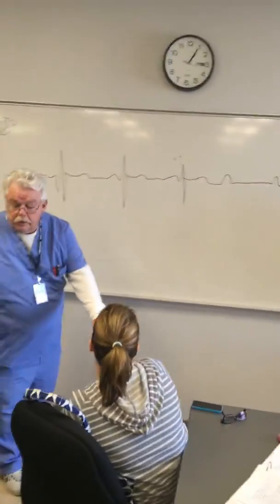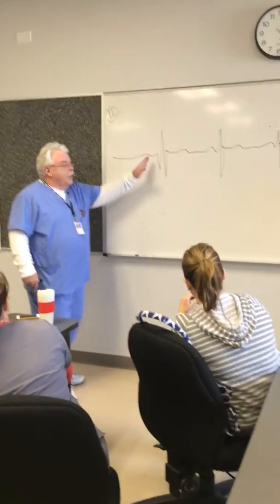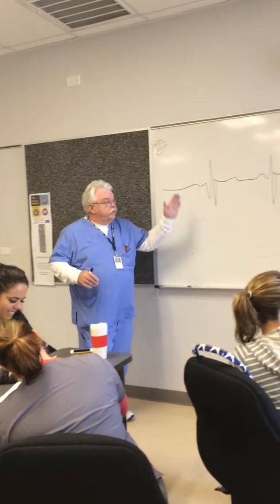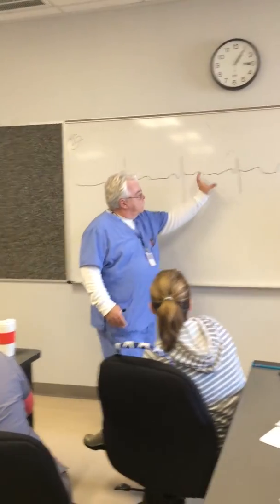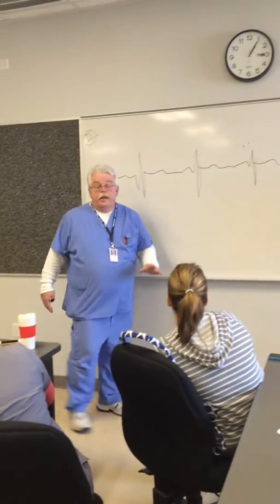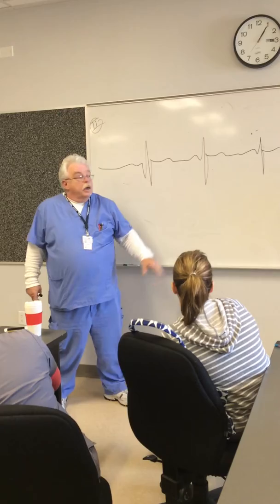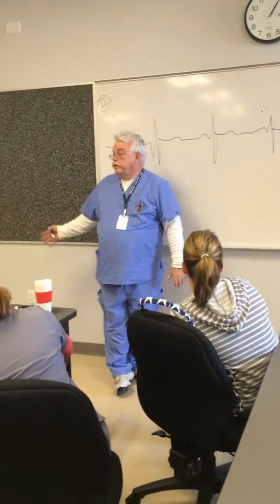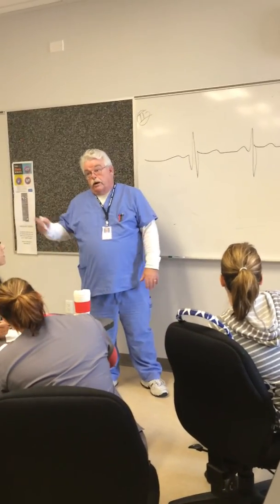If some P's just don't get through, then you have a Mobitz 2. Mobitz 1 is longer, longer, longer, drop. If these were long, longer, longer, drop, then you have a Wenckebach. These, despite my poor art, are the same PR interval. You just have a P wave with no corresponding QRS. There can't be any PR interval because you've got no R to measure it.